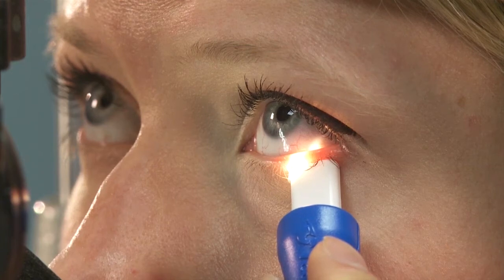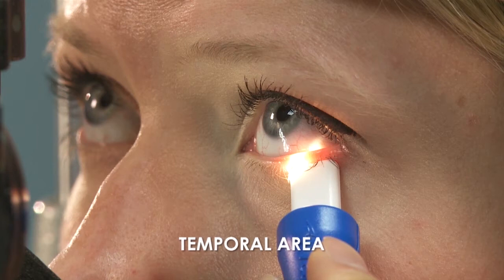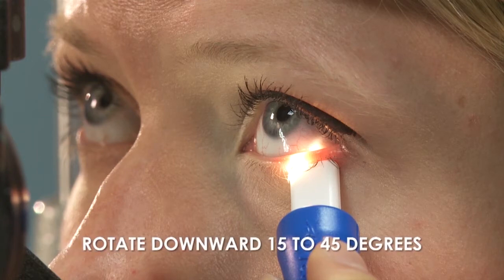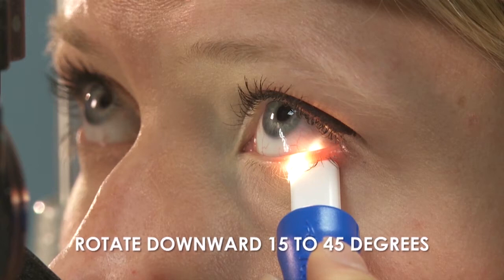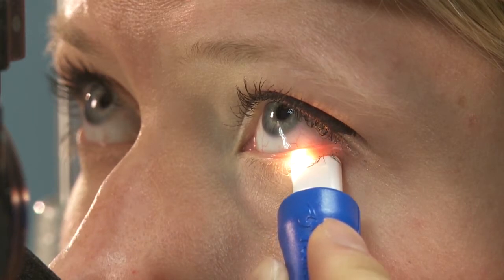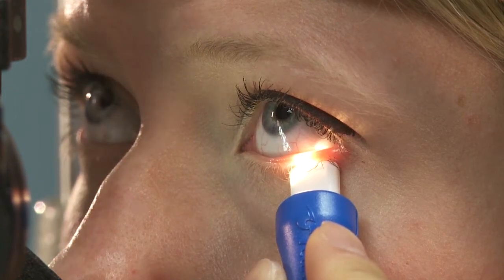Place the MGE onto the skin immediately below the lash line of the lower eyelid in the temporal area. Once full contact is achieved between the MGE contact surface and the outer surface of the lower eyelid, rotate the shaft of the MGE downward approximately 15 to 45 degrees. Depress the shaft midway, approximately 3 millimeters.